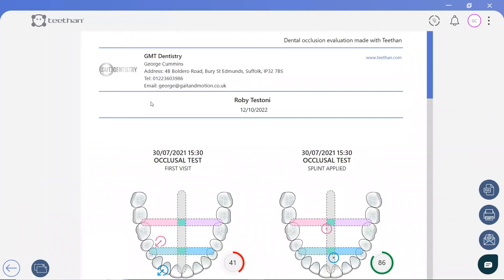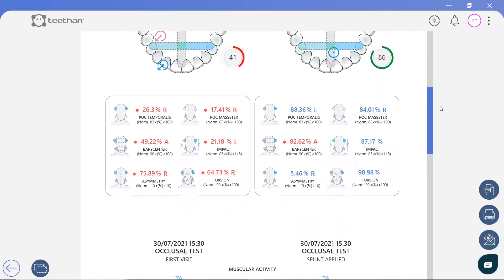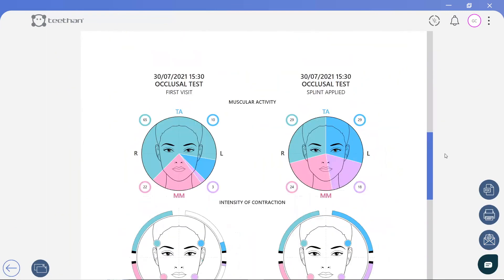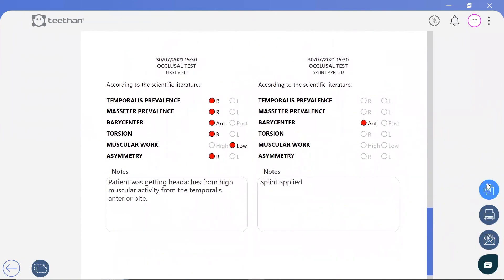With the click of a button, a full report is instantly generated and customised with the practice logo and details. All results are clearly displayed, along with the normative ranges and key findings highlighted in red. The report can be exported as a PDF, printed or sent directly to the patient via email.